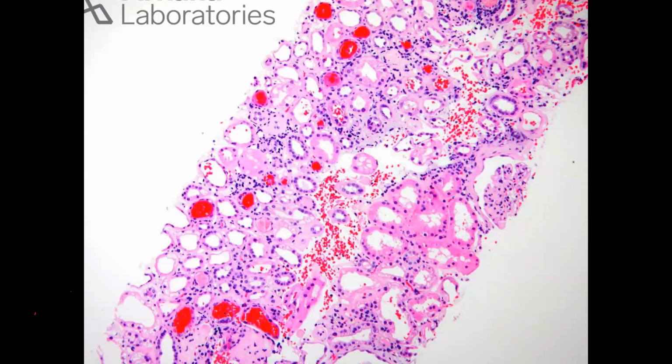But I think this is not to be correlated with the shape of the cast inside the renal tubule, whether it is globular or has a different appearance. I cannot group these two conditions together in a single scenario.